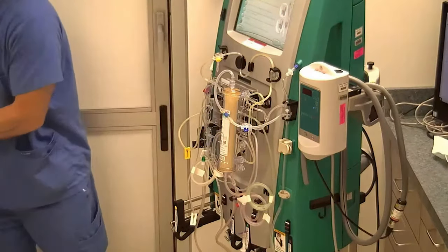And this is where we have the selections to enter our flow settings. Basically what you're going to do is look at your Cardex for your CRRT orders. Whatever the physician has ordered, you're just going to regurgitate that from your computer screen on the Cardex into the machine. So the first thing we want to enter is our blood pump speed. I hit the word blood, and you will see that will now become highlighted in red, and I'm going to take that up. Typically our orders are around 200 to 250, and I'm going to stop at 250.